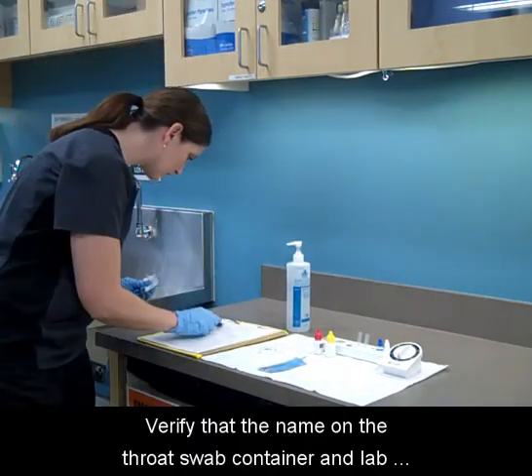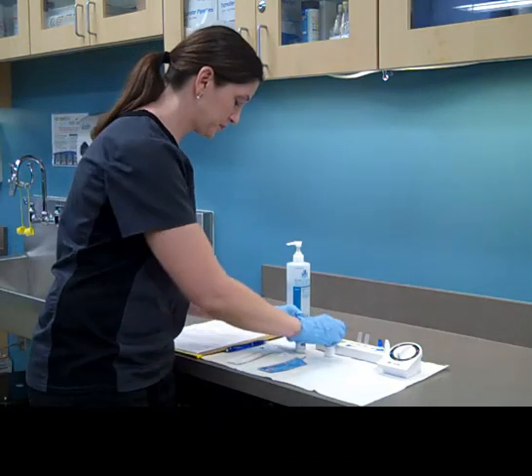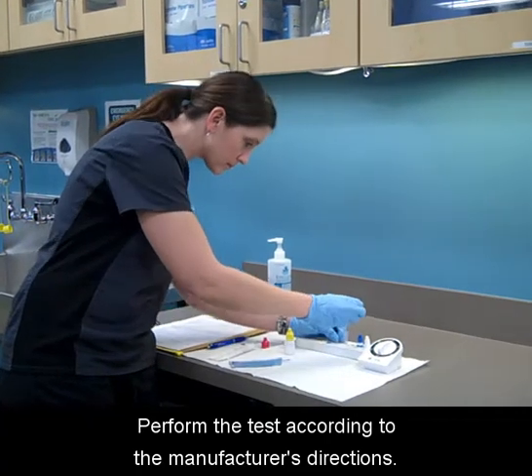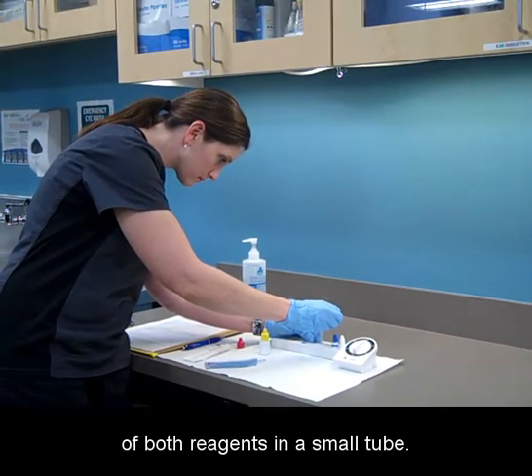Verify that the name on the throat swab container and lab requisition form match. Perform the test according to the manufacturer's directions. This test requires several drops of both reagents in a small tube.